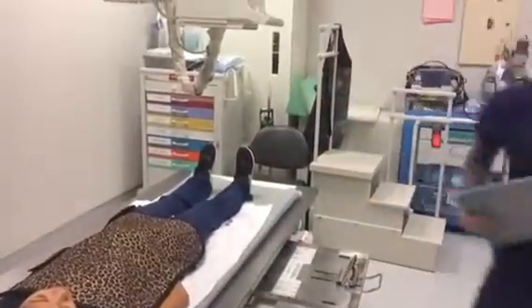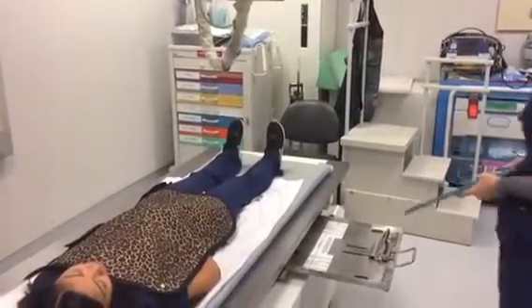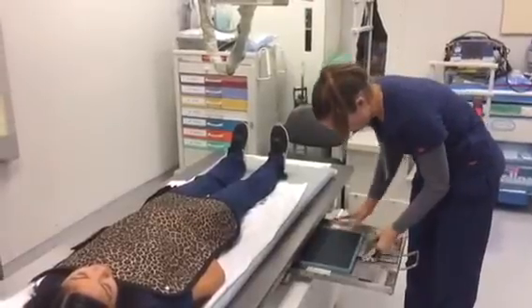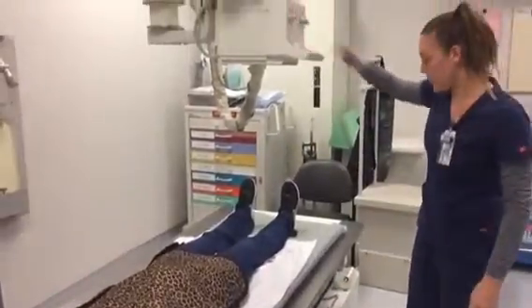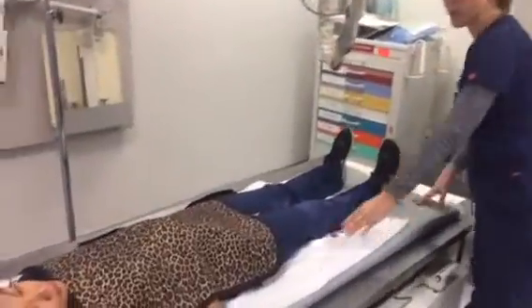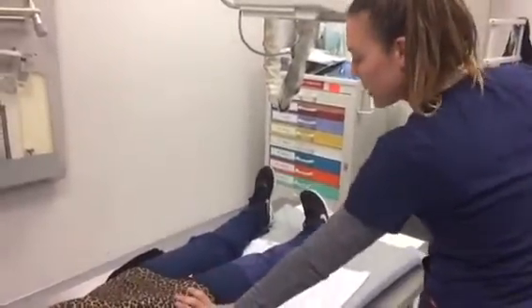So I will take this one out and I will be switching my IR. Same orientation, portrait, 10 by 12. Now for this projection, I'm going to have the patient log roll their leg internally at 45 degrees.